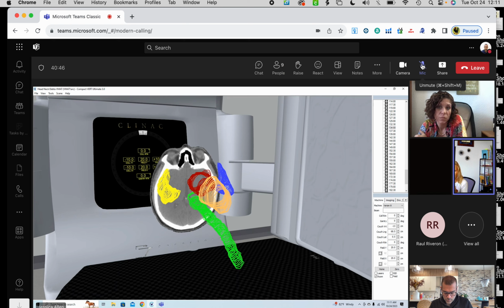And a question that I did ask somebody on the discussion post this week was, normally we have standard, not IMRT, but standard whole brain fields, right? So that standard whole brain is going to be a 90 and a 270, okay? Now, if I want to get off the optic nerve, where do I change my gantry angles to? So think of it in terms of here.